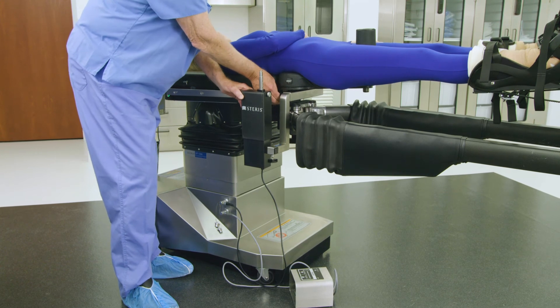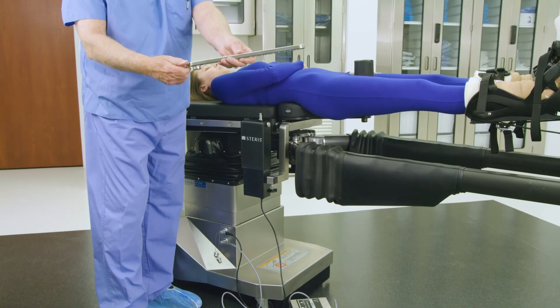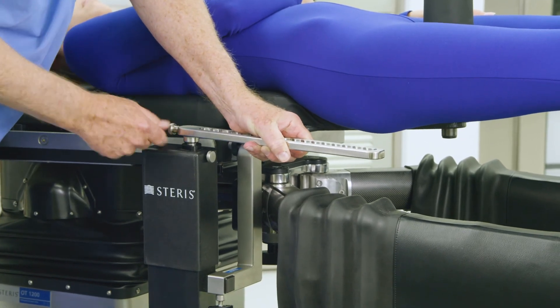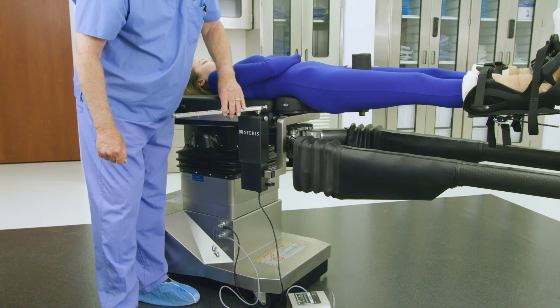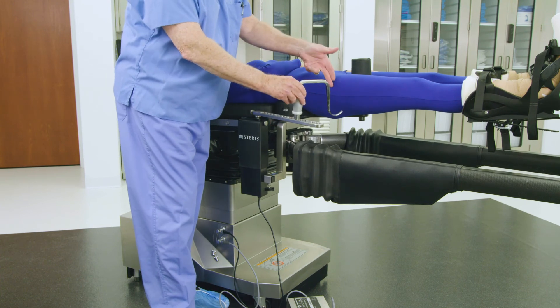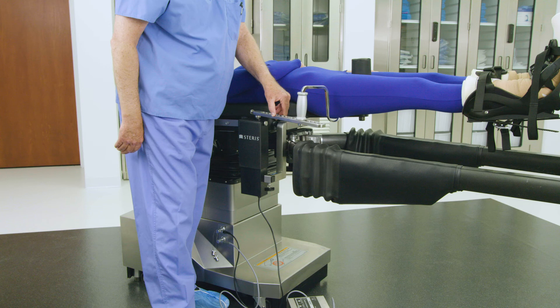When in an actual anterior approach total hip case, the femur positioner rail and femur hook will be used in the sterile field. At least 2 sterile drapes will be covering the femur positioner drive's gross height adjustment pin. Install the femur positioner rail over the draping and onto the gross height adjustment pin; the drapes will create a snug fit. Tighten the knurled thumb screw on the positioner rail to secure. Next, install the desired femur hook on the femur positioner rail. There are several femur hook openings along the positioner rail; the surgeon will choose the best position to match the patient anatomy.